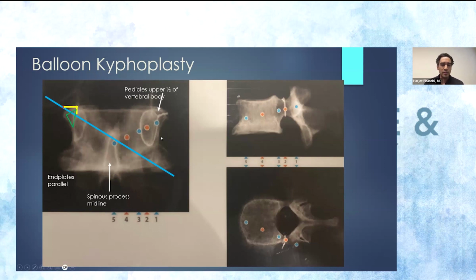As you can see on this picture on the left, when you're at that first mark, right on the lateral wall of that pedicle, you're basically docked on the pedicle on your lateral view. And as you move your needle more medially, you progress in the lateral view as well. The most important landmark here is that 3rd mark. As Dr. Brown was mentioning, this is the medial wall of that pedicle. And you want to make sure that you don't go past the medial wall of the pedicle in the AP view before you are past the posterior wall of the vertebral body. That's the biggest safety view, and we'll walk through this a little bit more.